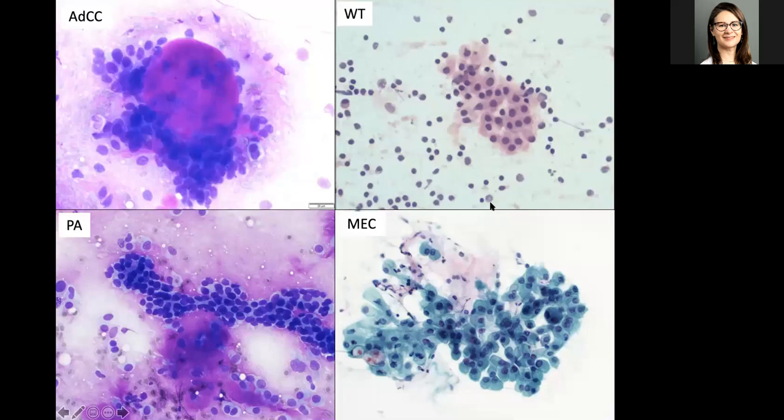And then the tumors. Sometimes on FNA for salivary, you can say, oh yeah, that's definitely a pleomorphic adenoma, done. But sometimes the morphologic features are overlapping and a descriptive diagnosis may be made, such as, I feel like this is a neoplasm, but I can't really put it in a particular bucket. And that's this column on the left. So the bottom left ended up being a pleomorphic adenoma, and the top left is an adenoid cystic carcinoma.